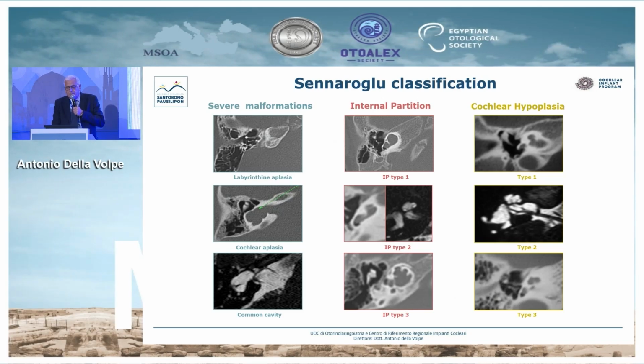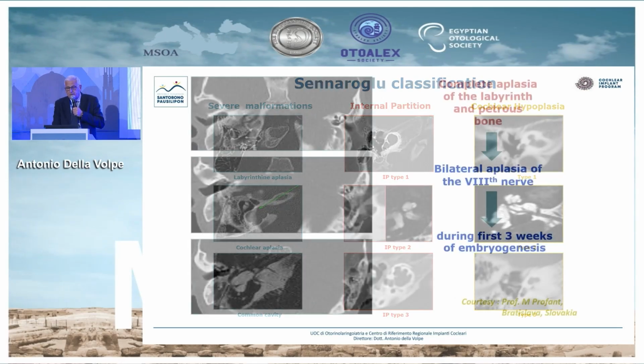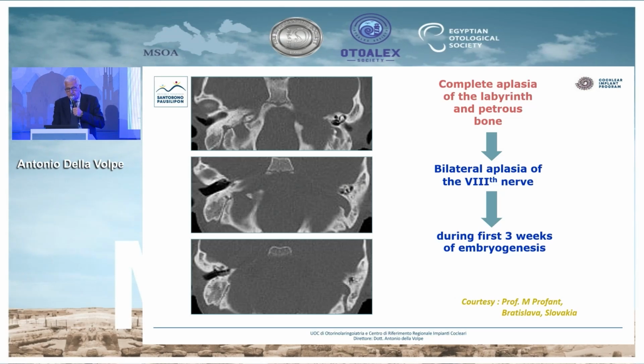In our experience, we use in most cases the MED-EL cochlear implants because the portfolio is very large. We can have the right electrode for each kind of malformation.